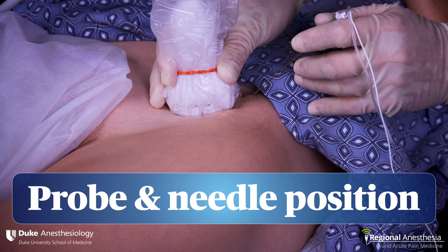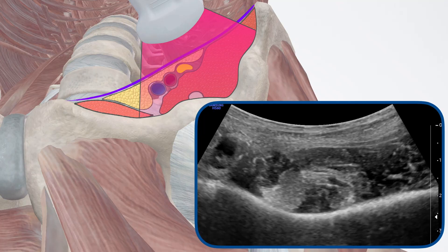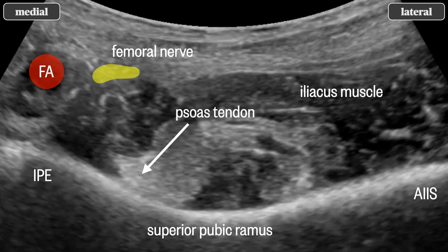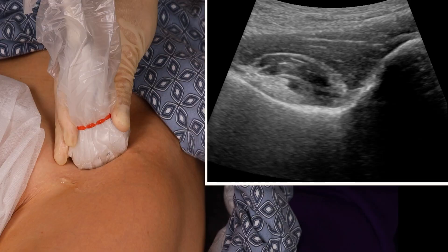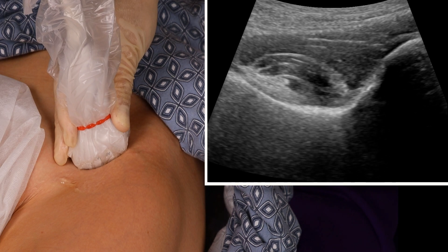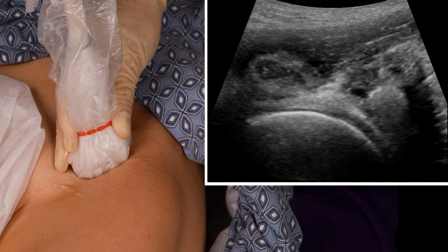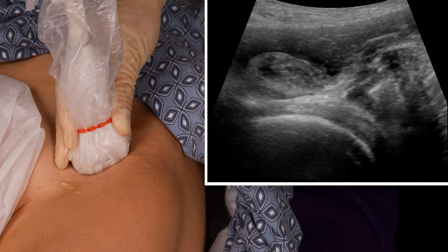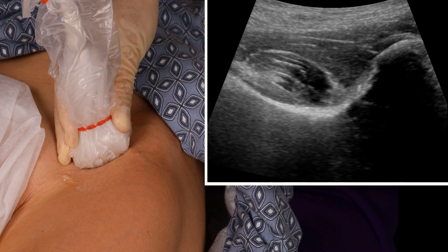The ultrasound probe is placed over the inguinal crease in the same orientation as the crease. This should result in an ultrasound image like this. Here we see the superior pubic ramus with the iliopubic eminence rising on the medial side and the anterior inferior iliac spine rising on the lateral. We can clearly see the iliacus muscle and the psoas tendon. Sometimes the bony anatomy is not immediately obvious, and there are two maneuvers to get to the right spot. First, slide the probe distally along the thigh until the spherical head of the femur is visualized, then apply a very slight tilt or shift back cephalad to get to the pubic ramus.